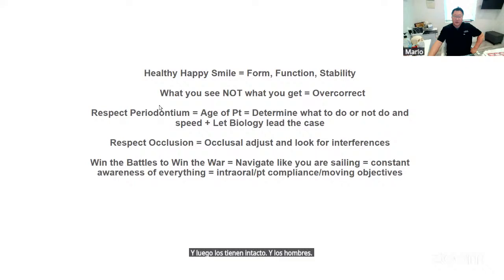This depends on a lot of things, right? So the next point I want to point out is we really got to respect the periodontium, right?